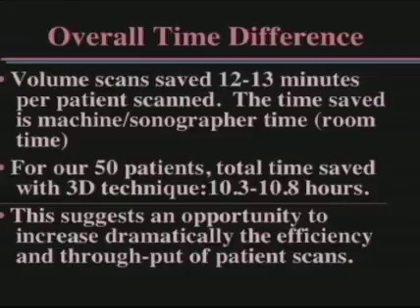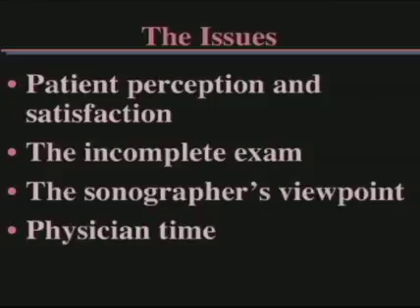This suggests an incredible opportunity to increase the efficiency of our scanning in the future, and also to standardize it so that we are not as operator dependent.